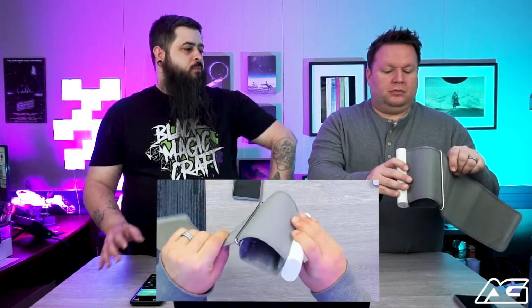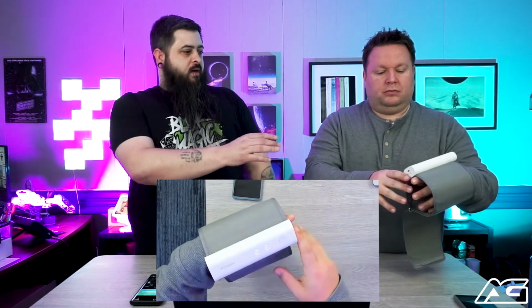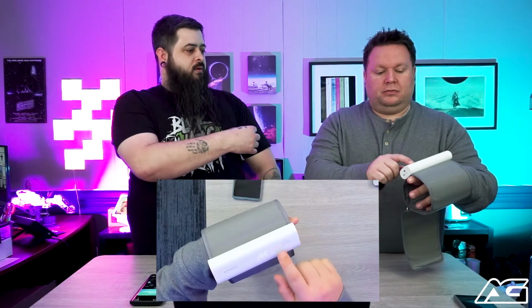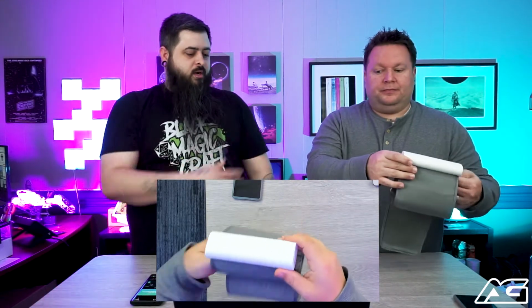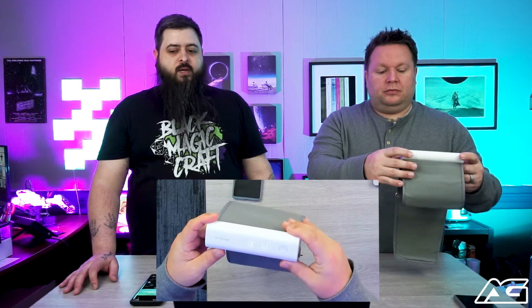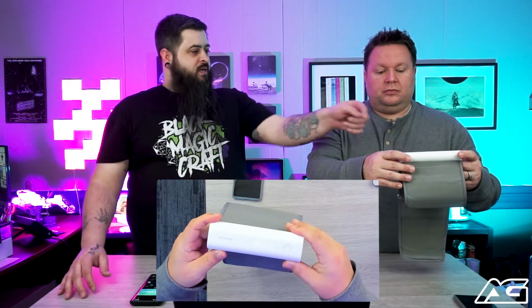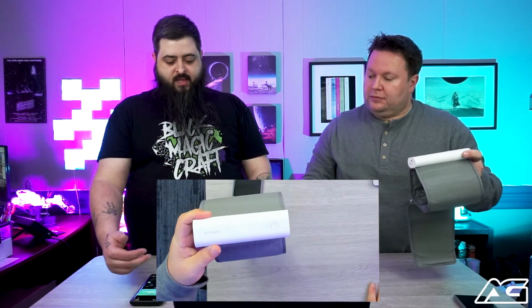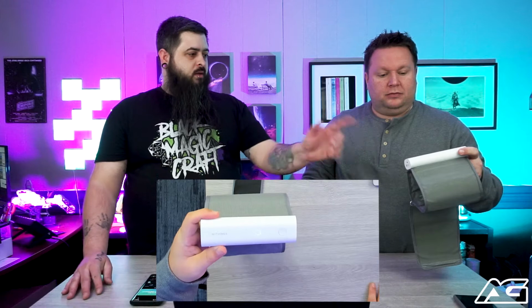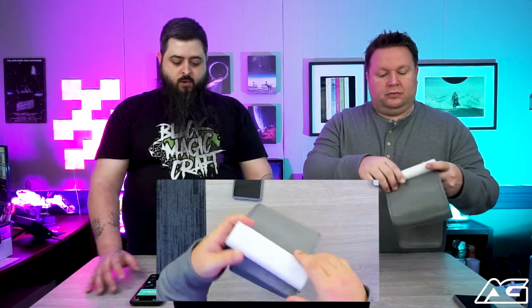So all you do is you put the cuff on your arm, and they say to keep the dot or that light kind of in line with your heart. Okay. So you just put it on and keep your arm nice and relaxed. Hit the button. It says my name there because I have it synced up to my HealthMate app. Okay. And then it'll give you a readout on the device, and then it'll also give you a readout on your phone.